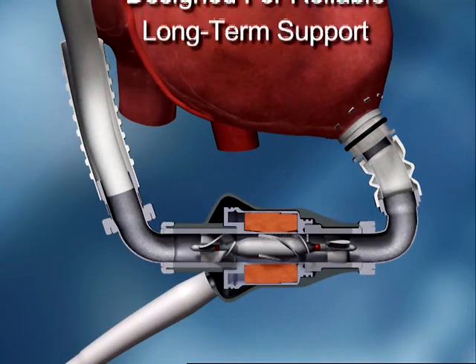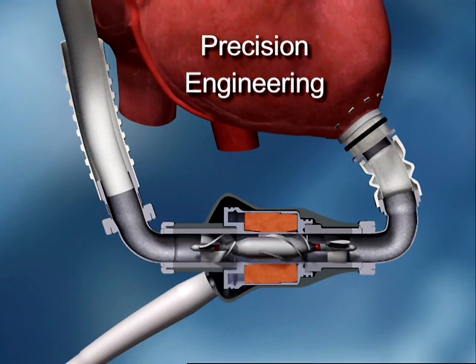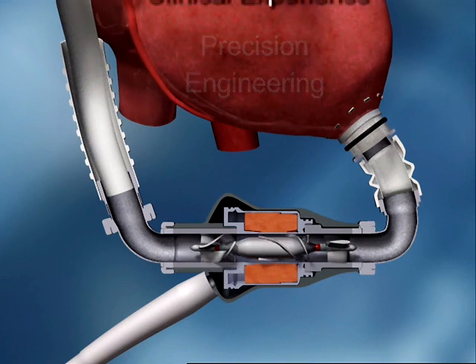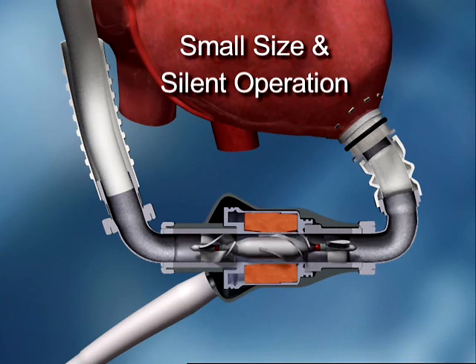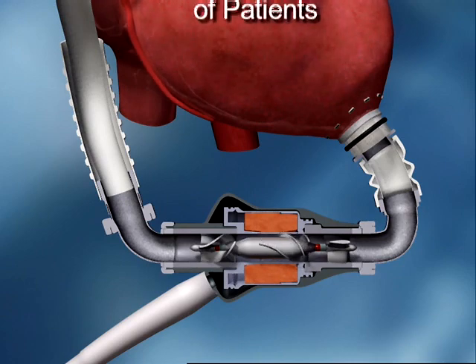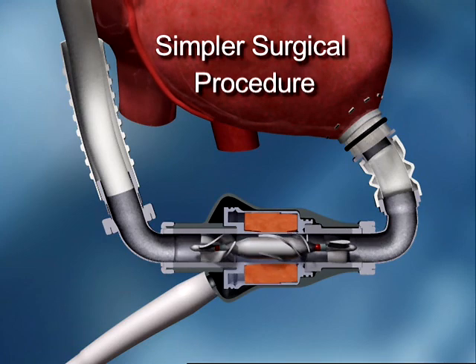The HeartMate 2 is designed for reliable, long-term support. It incorporates precision engineering and over 30 years of clinical experience. Its small size and silent, vibration-free operation make it appropriate for a wider range of patients. Its reduced size also contributes to a simpler and considerably shorter surgical procedure.